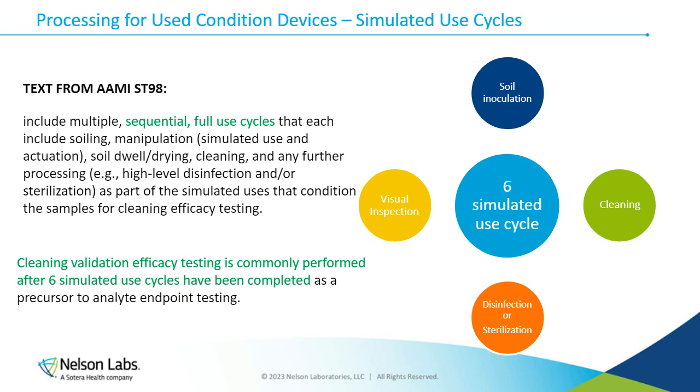That's exactly what we're doing for simulated use: the soiling, the cleaning, and the disinfection or sterilization, depending on your end processing point. And then we do a visual inspection to see if the cleaning is adequate. And over time, in 6 simulated use cycles, do we see anything that's retained?